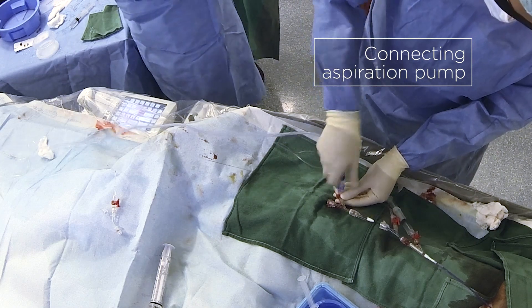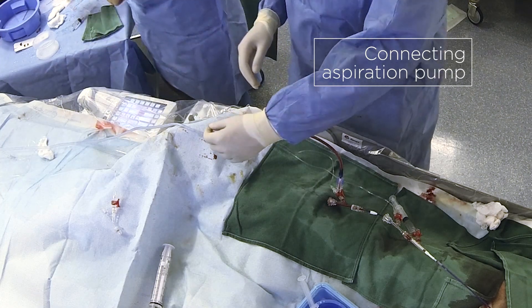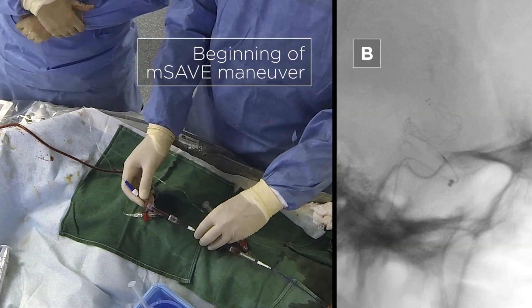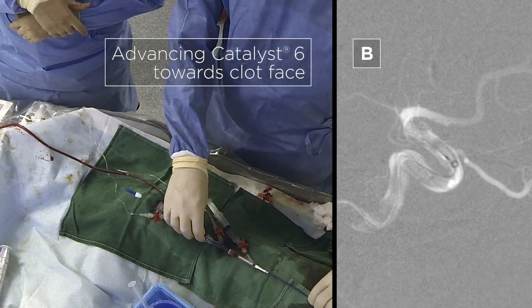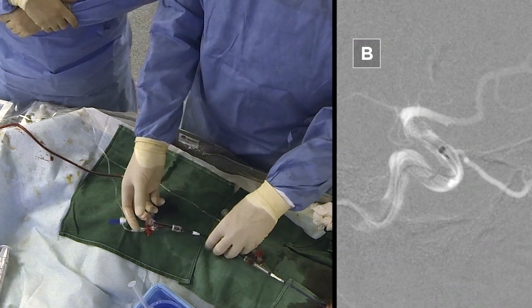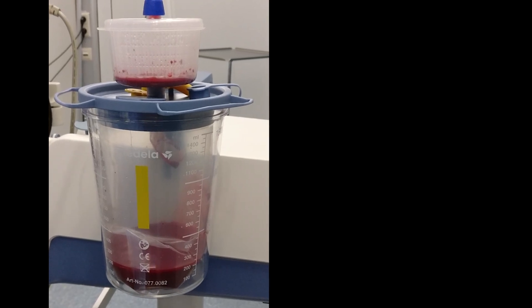The next step is to connect the aspiration pump. We are still in the free segment of the carotid and have flow towards the pump. The pump is connected to the aspiration catheter, which is still in this free segment. We push the aspiration catheter over the wire of the stent retriever towards the clot. At some point we arrive at the face of the clot and there is no more flow in the system — you can see on the pump that blood flow has stopped. You can then wait a couple of seconds to suck the proximal part of the clot.